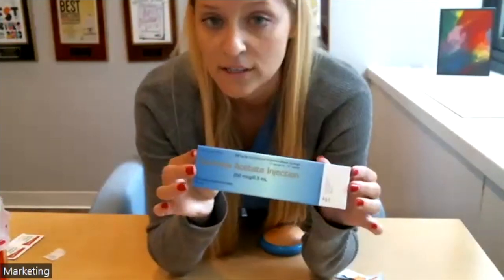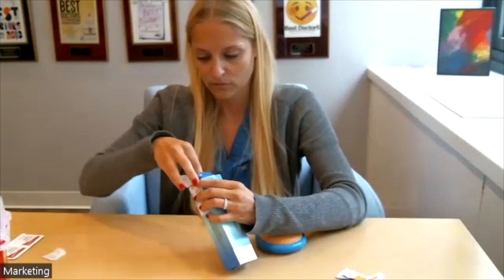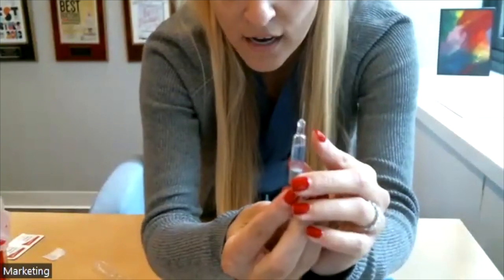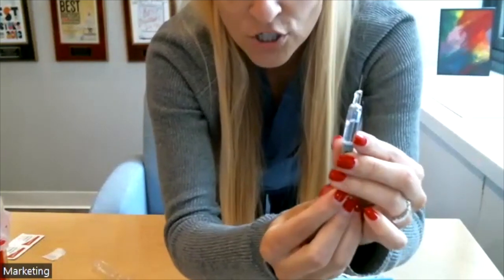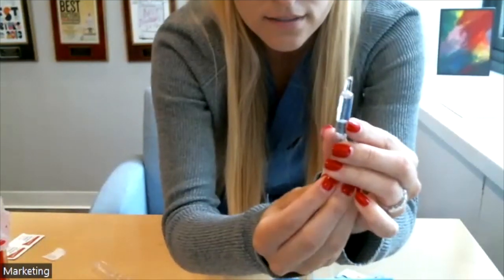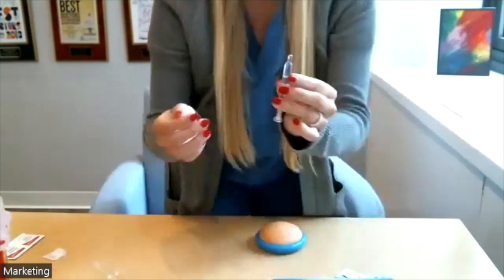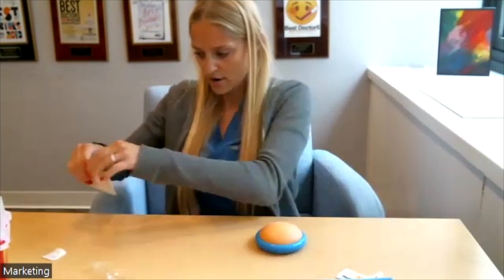The next drug is Ganirelix — the Ganirelix acetate injection, a 250 microgram pre-filled syringe. This one's pretty easy. Take the top off. You'll notice there's some air between the top of the needle and the medication vial. Pull down on the plunger to loosen it, then push up very slowly until you see the first medication bubble come out at the top of the syringe. Now you know the needle is primed and you're not going to inject any air. You can slowly recap it to lay it down flat and prepare your injection site.